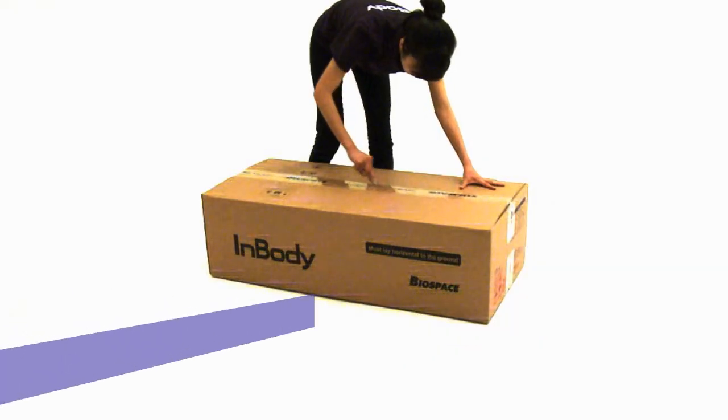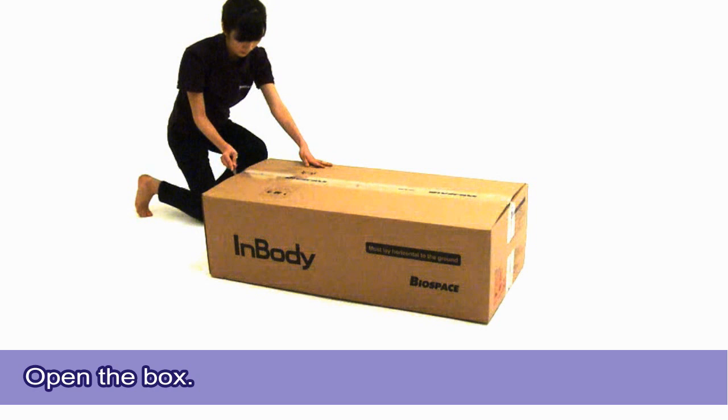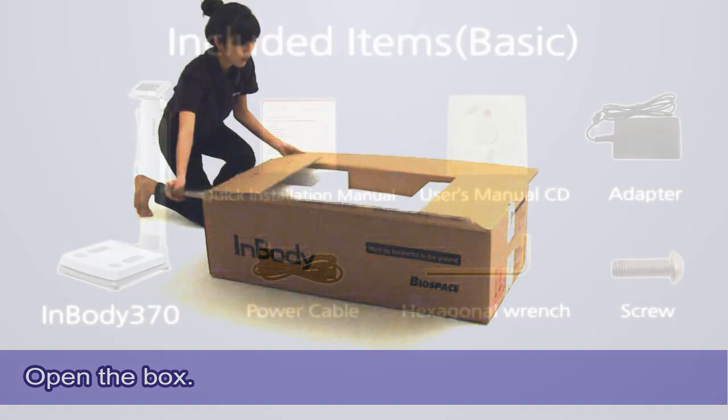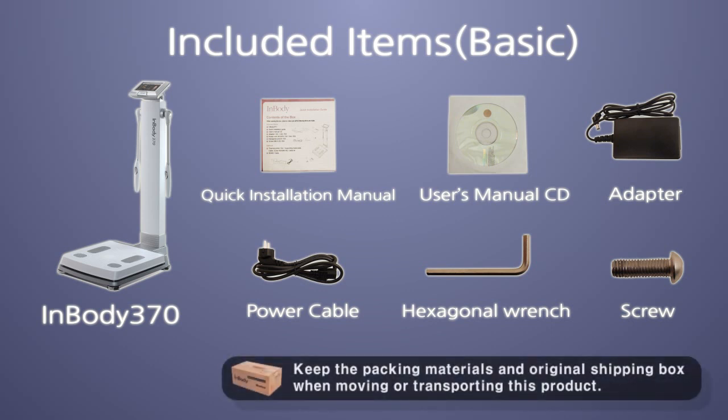Step 1: InBody installation. Opening the box. Using a knife or box cutter, carefully cut the box to open. Check the contents of the box for the following: InBody 370, quick installation manual, user's manual CD, adapter, power cable, hexagonal wrench, and screw.